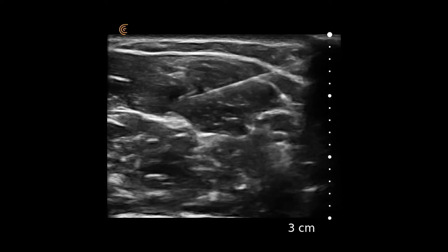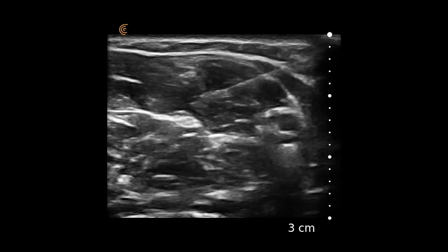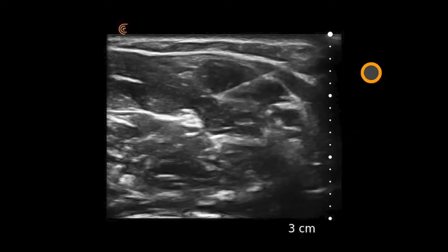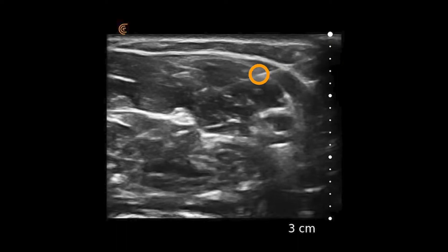In this video we see the linear scanner on a nerve preset here in the transverse plane on the medial forearm. In the center of the screen is the median nerve, which is going to be anesthetized in an ultrasound-guided nerve block.